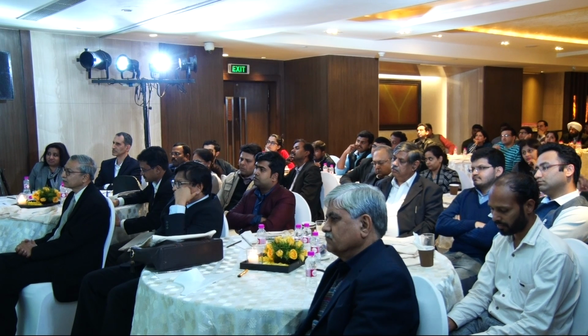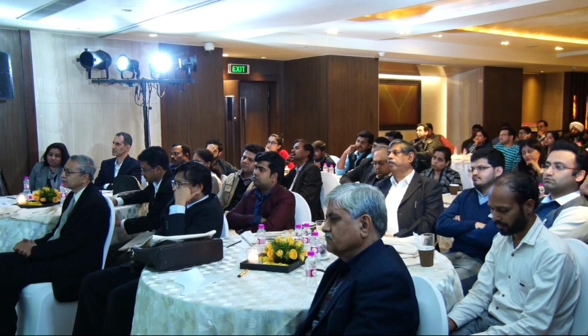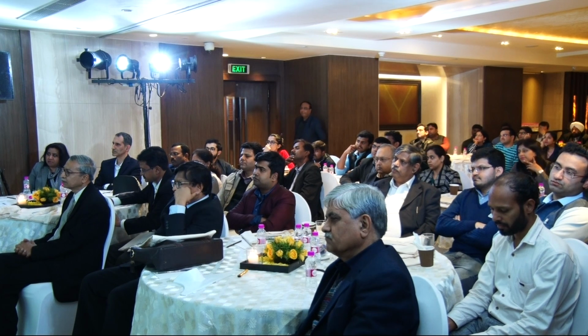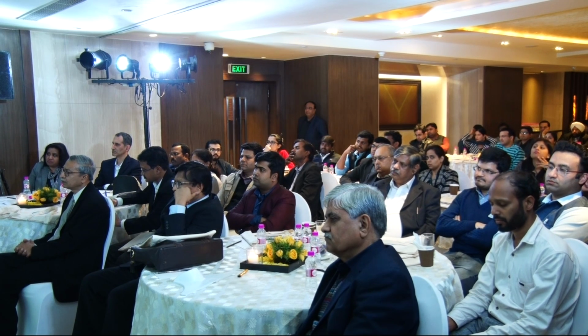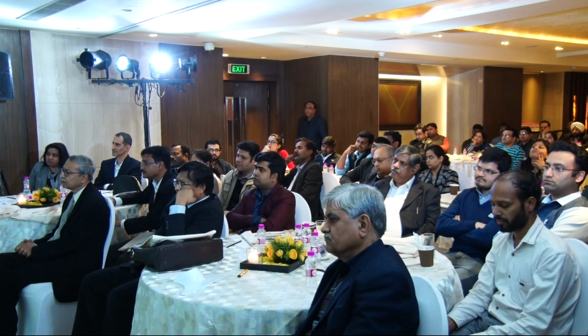But if you know ahead of time that these features that correlate between the two traces are real, and that they are a characteristic of the system and not that your patient is moving, you can address those proactively rather than retrospectively just evaluate them and say, what happened here? Did the patient move? So we can do a 1D feature-based registration of those two signals.